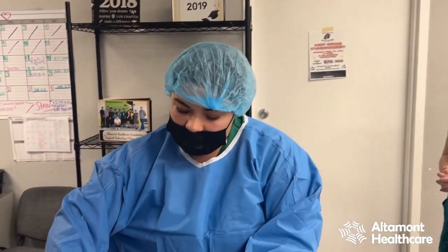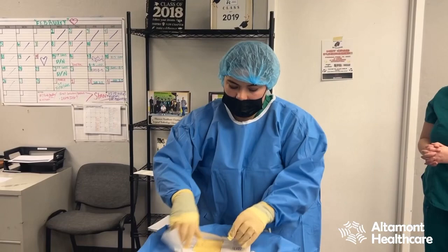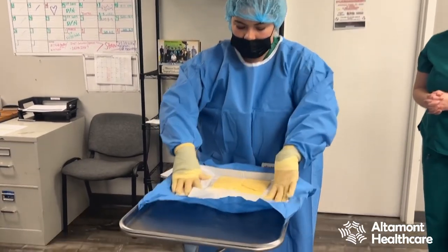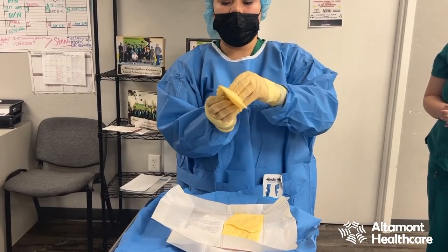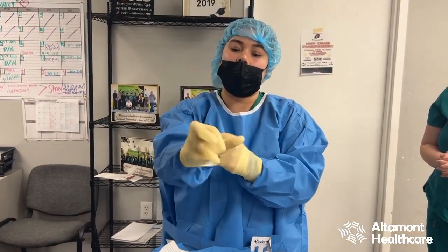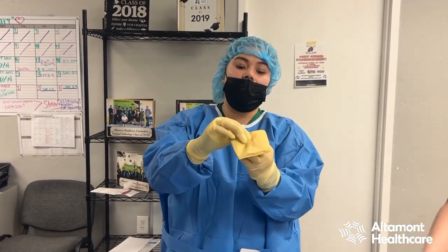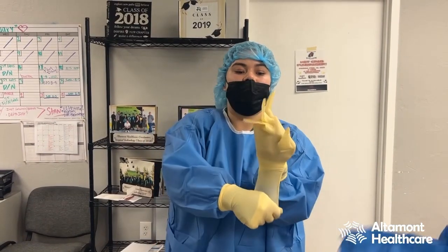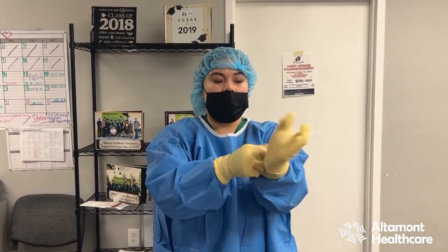The second pair of gloves will be the same thing — you're going to open them up. I'm going to start with the right and do a flip; you'll see how much easier these go on. Same with this one: fingers towards me, grab the bottom lip, top, flip — and gloves are on.